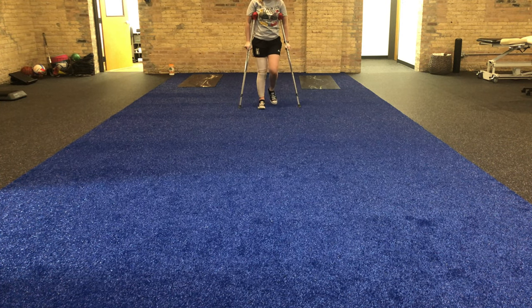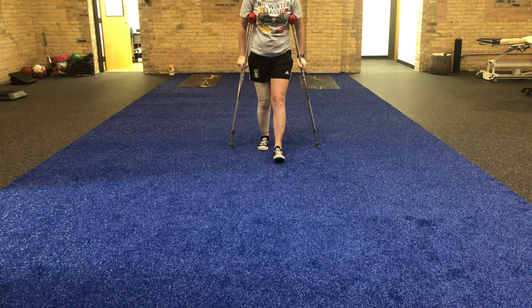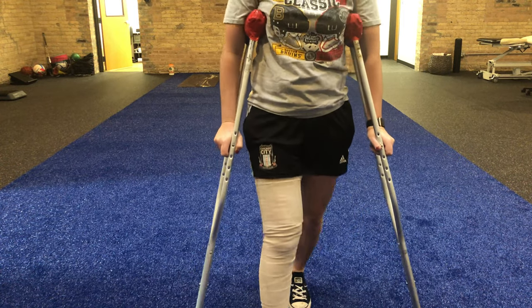Go ahead, walk to me. Good, so this is weight-bearing as tolerated. You can see that the patient's putting her crutches with her right surgical leg. Good, we'll turn around and we'll go back.